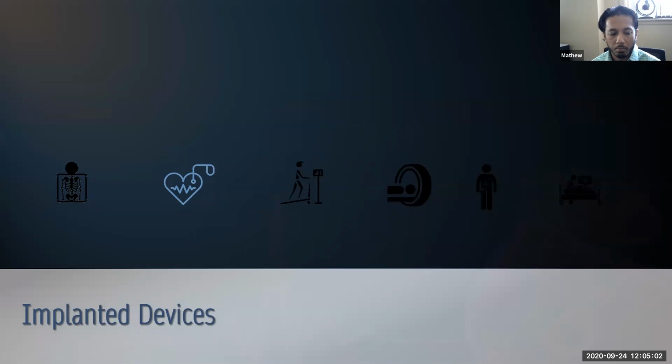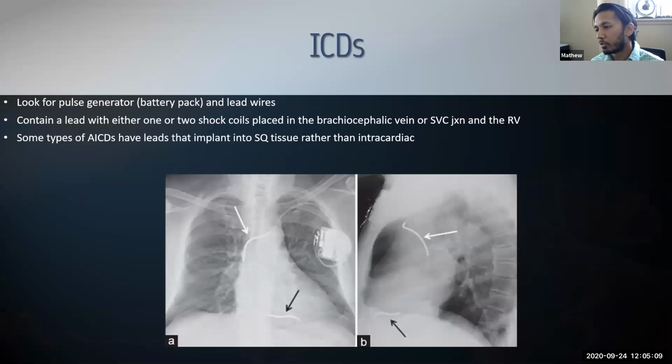So it's very quick because really the intent is not to go over x-rays, but I did want to make it known that x-rays should be considered on all of our patients who are going through any kind of cardiac workup, because we have them on almost all of the patients coming through the ER.